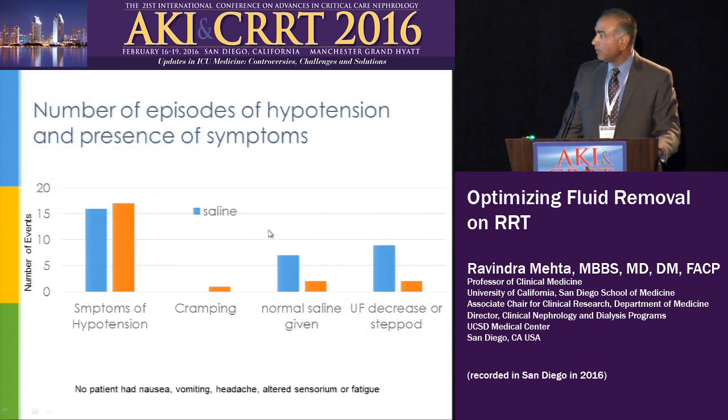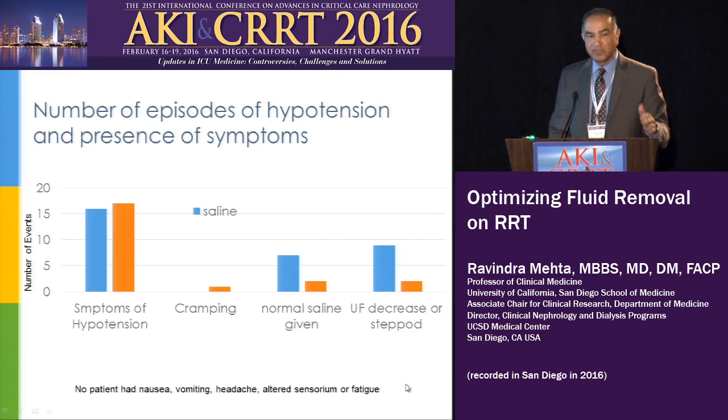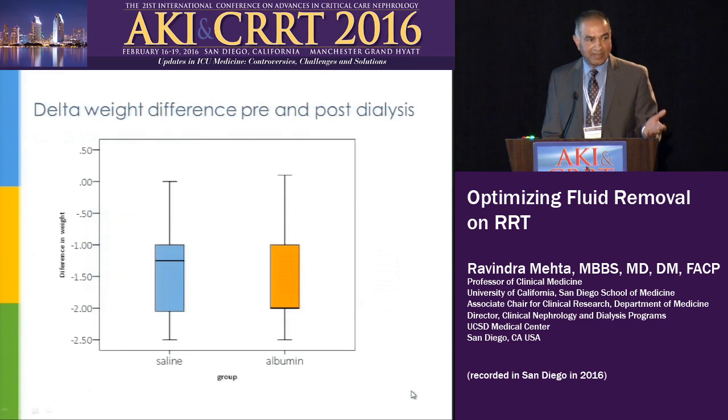But what is more important here, in terms of albumin and saline, is the overall hypotension and presence of symptoms. And what you find is that there were more sessions in the saline group where you had to decrease the ultrafiltration or stop the treatment in that setting itself.